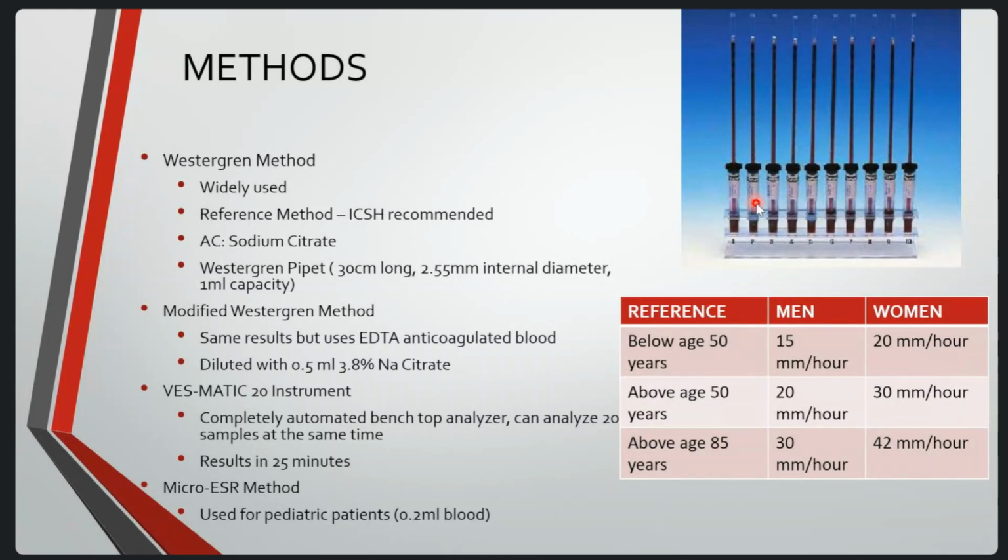For the modified, we can now buy these tubes na may ESR pipettes, so that it also yields the same result with EDTA. So you can use a black top or a purple top sample, diluted with 0.5 ml of 3.8% sodium citrate.